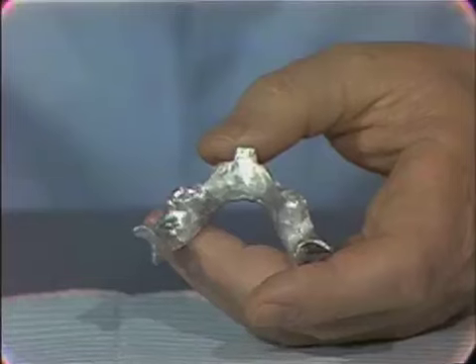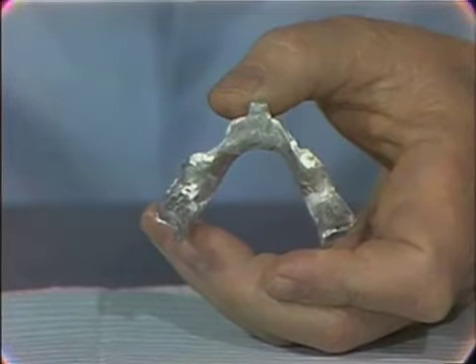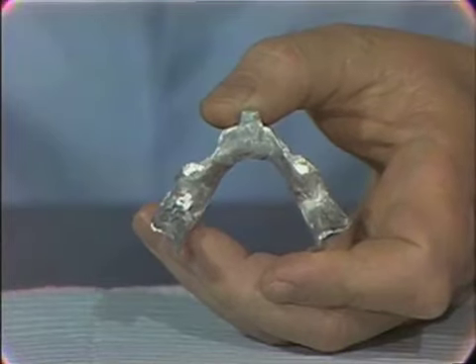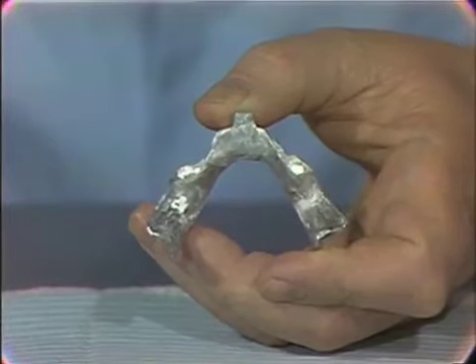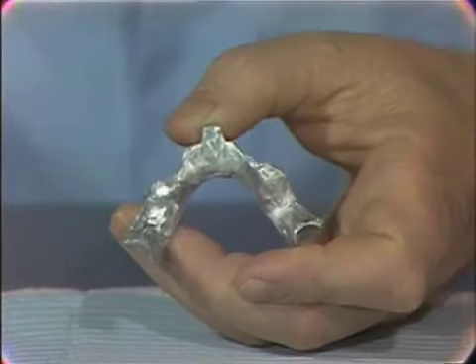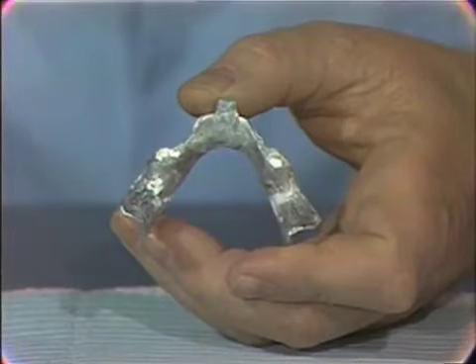The purpose of the impression tray is to act as a vehicle to carry the impression material into the mouth. The impression tray in no way dictates the way the impression is formed. The resting tissues are the things that dictate the way the impression is made, and the tray should not interfere. Therefore, it sets certain limitations on the tray.